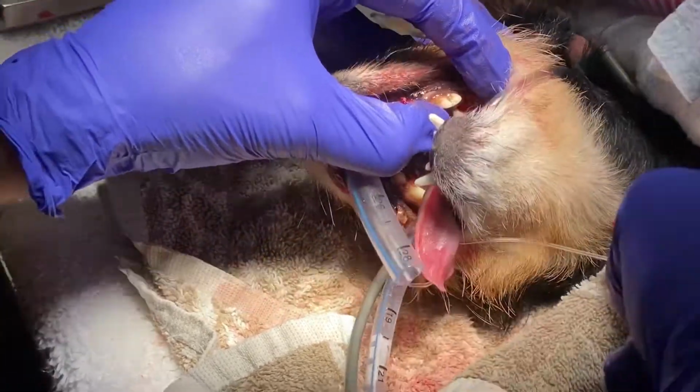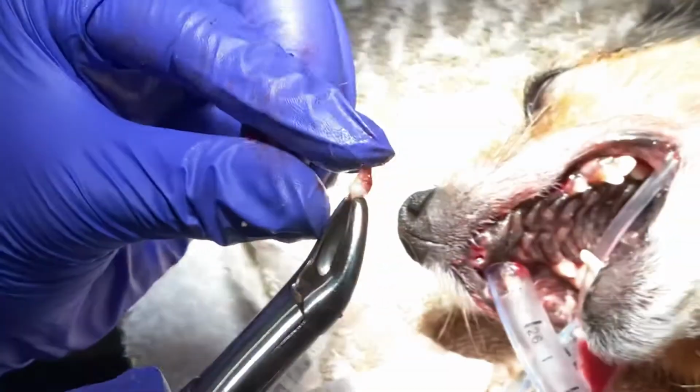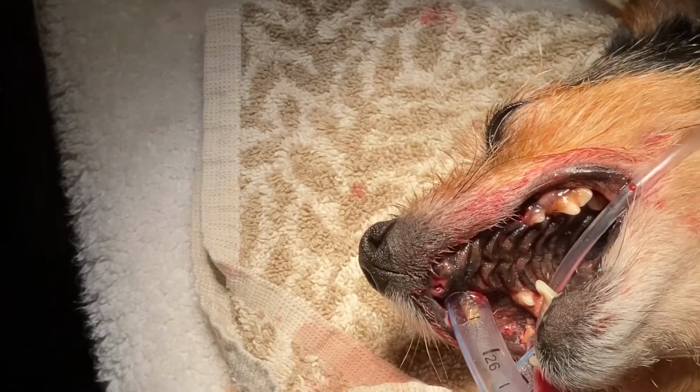Put some outward pressure on it and then twist a little bit. It comes out in one nice solid section. 1 root left.